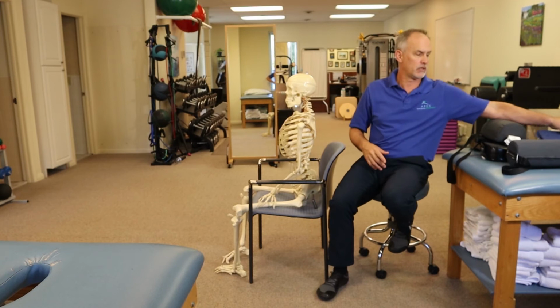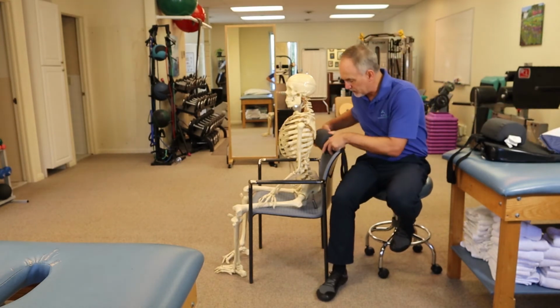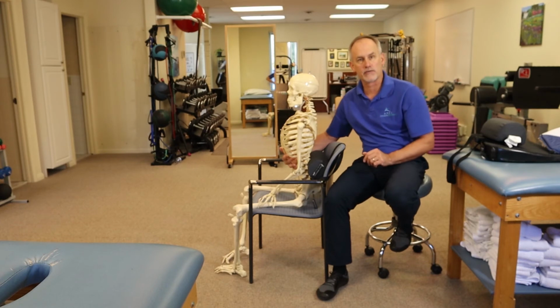So if we're using the lumbar roll right here, the McKenzie one, you can take it and you want to stuff it right behind the back here. I'm going to show you when I put it behind my back. And all we're doing is creating a little bit of that, we're helping that curve, okay?